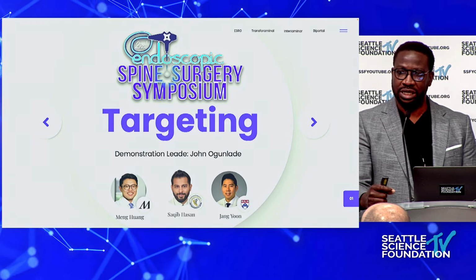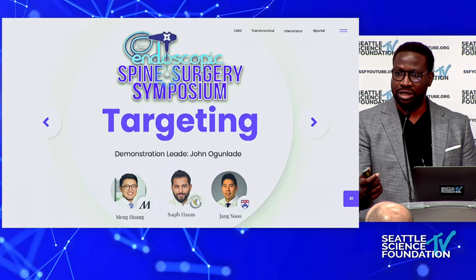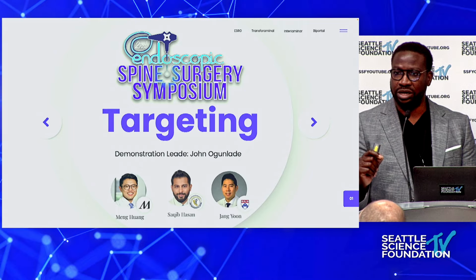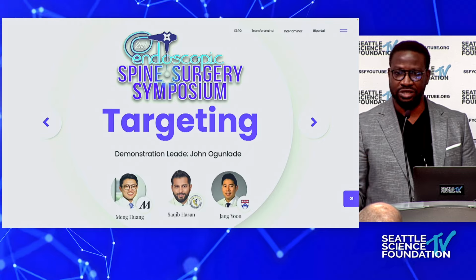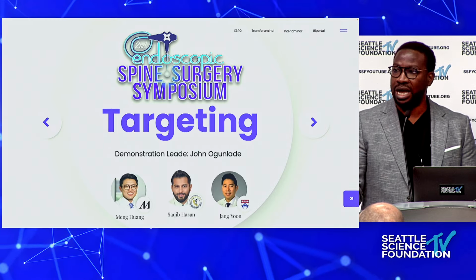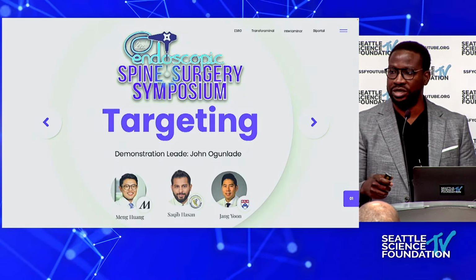And I would say it's even more important as you're making these small incisions, using these small instruments to target a very specific part. The other thing we don't think about is that there's always going to be, to some degree, a little bit of tactile feedback that you're looking for. If you're targeting a specific landmark, let's say in the transforaminal approach, you're trying to get to the SAP. If you feel bone and you don't feel it slide forward into the foramen, then maybe you're not on the SAP, and that's when you want to contact bone, take a lateral, confirm that you're where you think you are, go back to an AP, and progress from there.